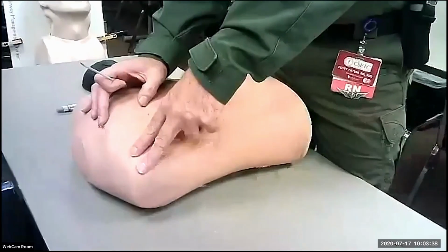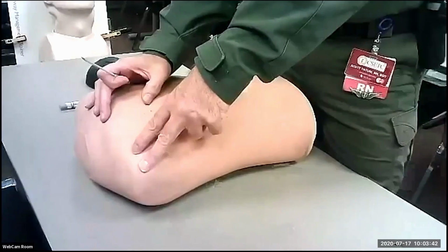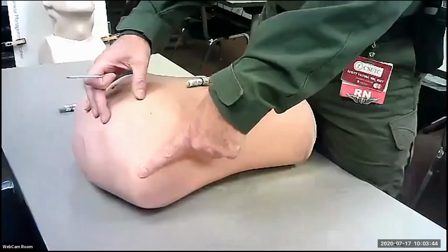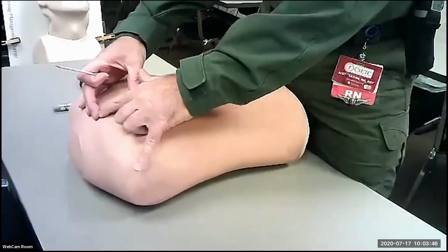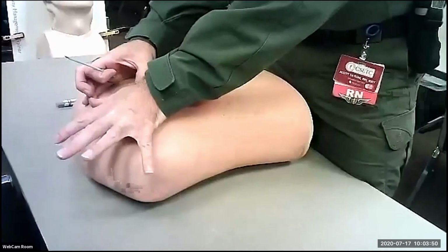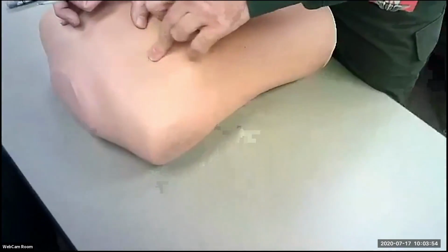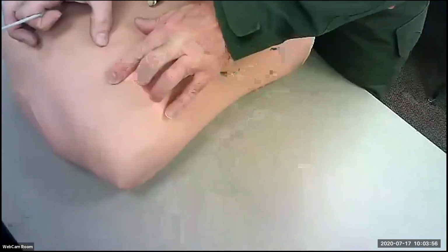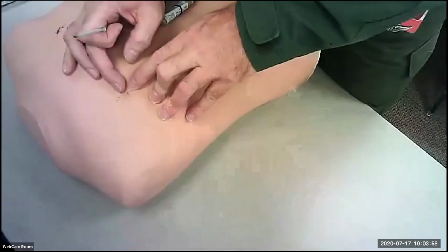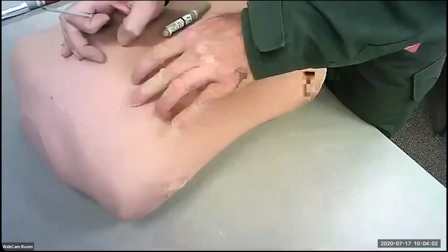Intercostal space is in between your ribs. So the second space between your ribs, mid-clavicular, your collarbone, all right? So to be right in the middle, you can do it one of two ways. You can get all the way down on the AC joint, way far out, and put your thumb in the jugular notch, drop your middle finger and roll it up. Or on this one, just go all the way up, drop my middle finger, roll it up.